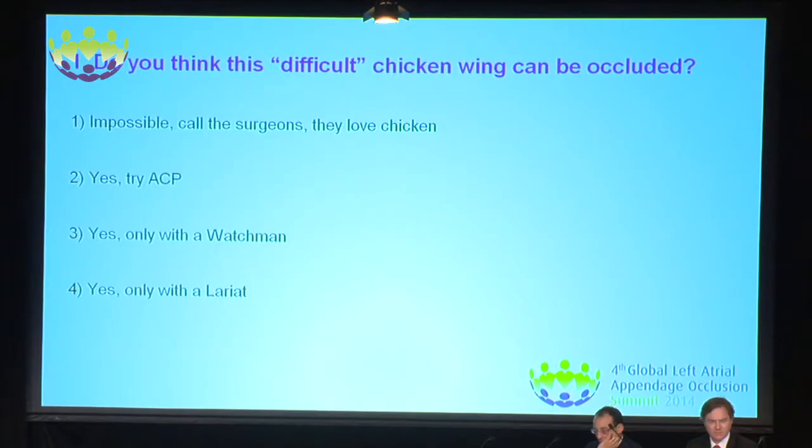And here comes my first question. Do you think this difficult chicken wing can be occluded? Impossible, call the surgeon? Yes, try ACP. Yes, only with a Watchman device. Yes, only with a Lariat device. Please vote.